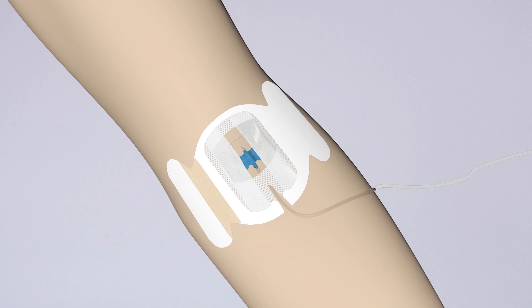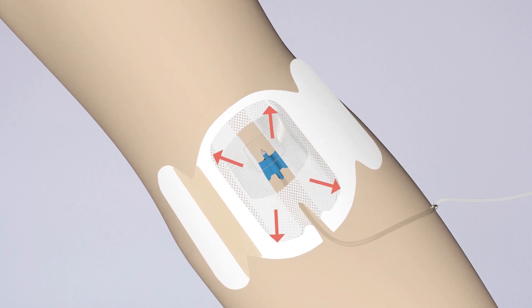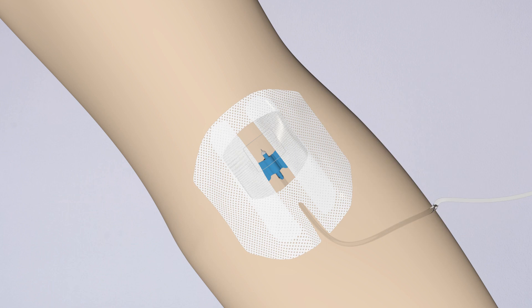5. Smooth down the dressing from the centre toward the edges. 6. Slowly peel off the paper frame, while smoothing down the dressing edges with your fingertips.